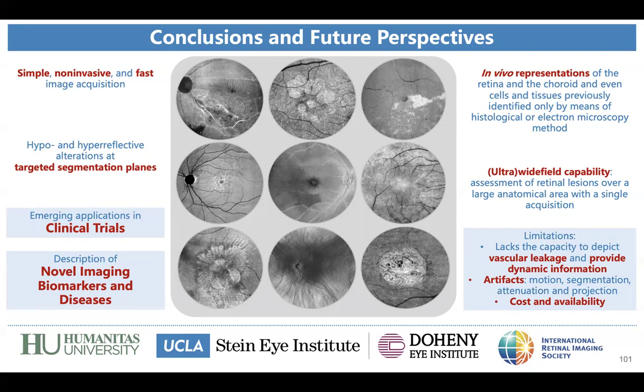That's why I love en face imaging and why I use it a lot and talk a lot, and also it's the reason that I sent you a text. Can you send me your full text, please? It was the start of our discussion.